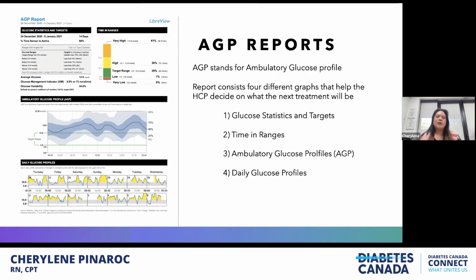So looking at this report, it's a one-pager. It helps the healthcare professionals just at a glance look at your stuff and say, okay, this is where we need to work on. So the best thing about these reports is that we could take it apart and go a little deeper with the patients.